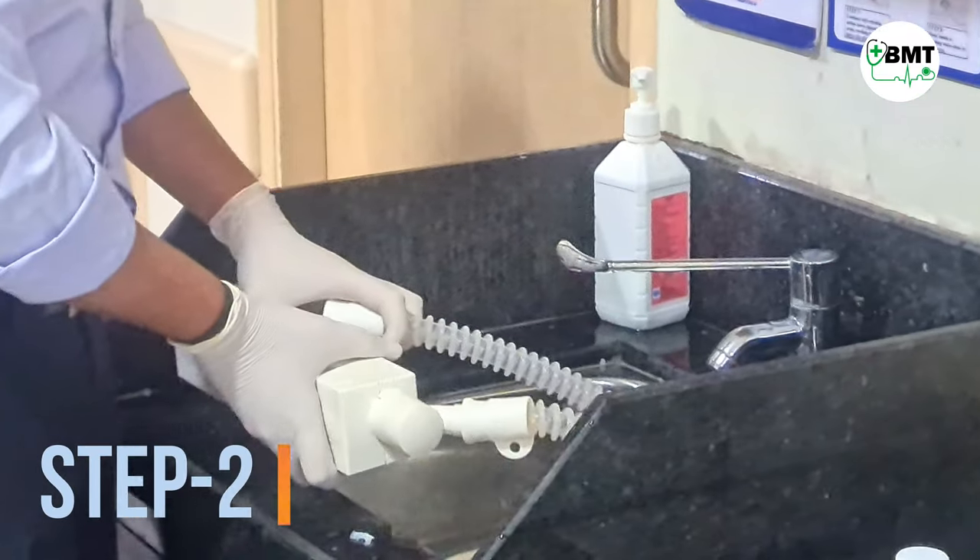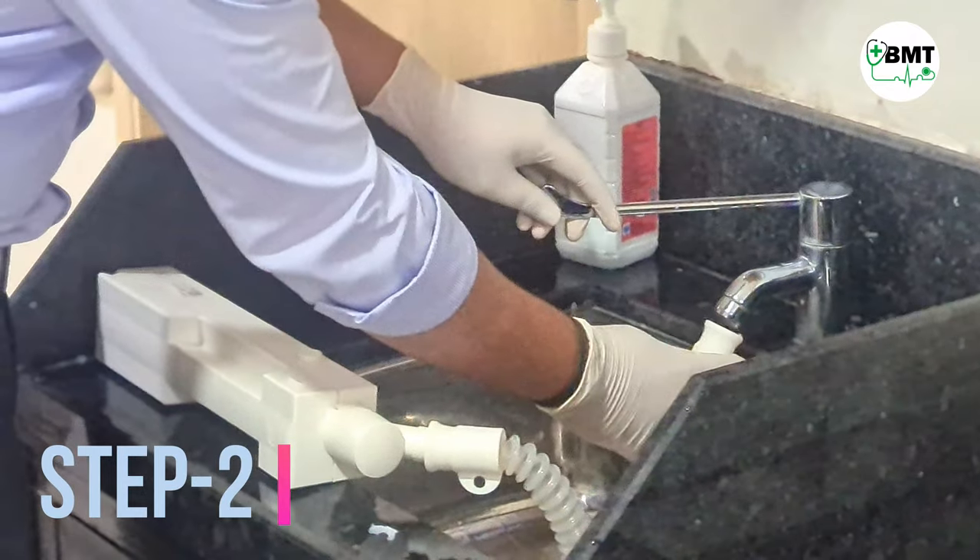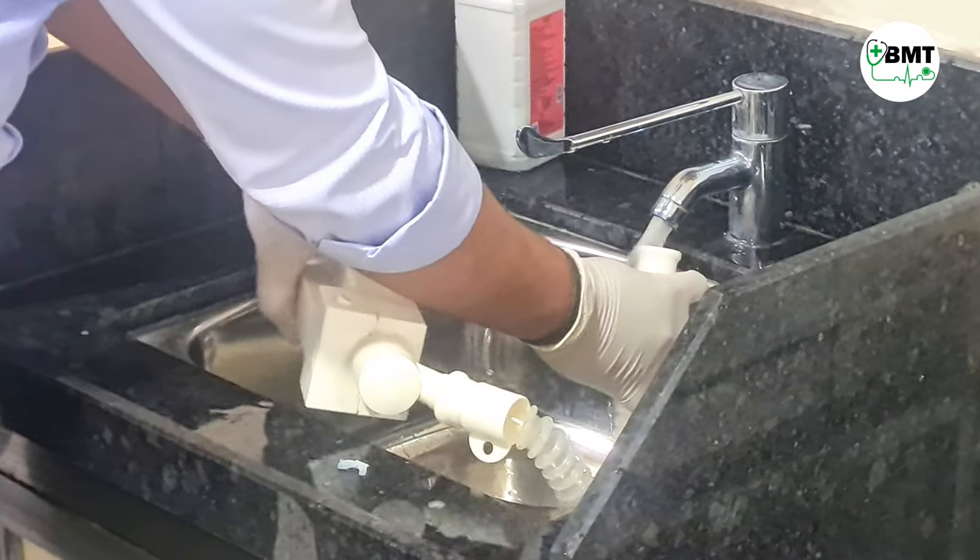Step 2. Take a tubing, connect one end to the expiratory port and the other end to a flowing water tap.